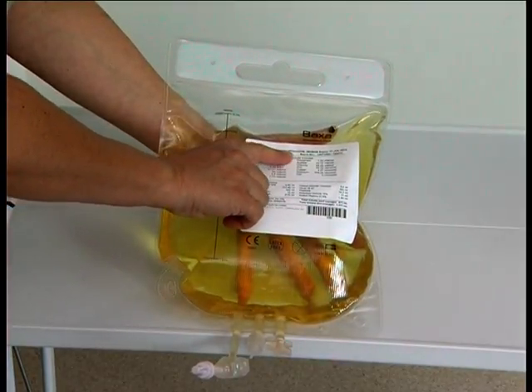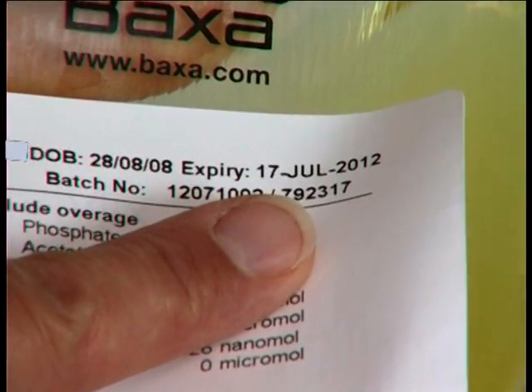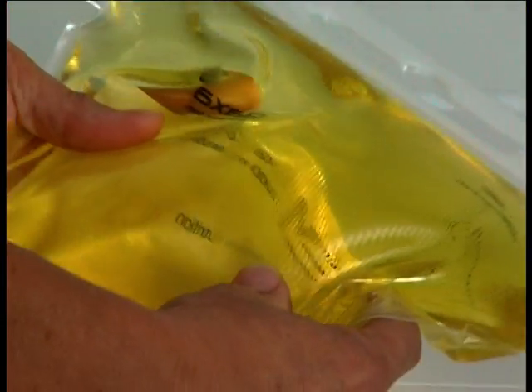Check the label to make sure it has the correct child's name and date of birth on. Check that the expiry date is not passed, and check that the fluid volumes have not changed unexpectedly.